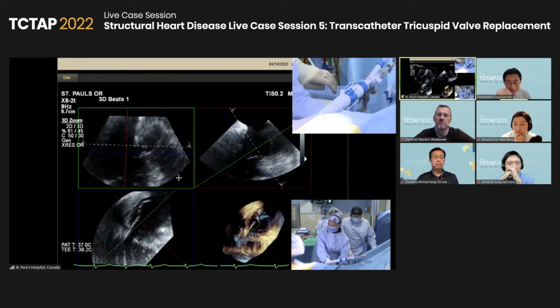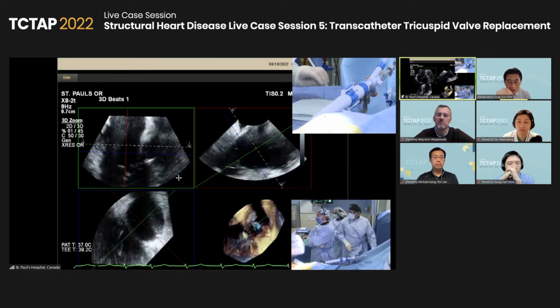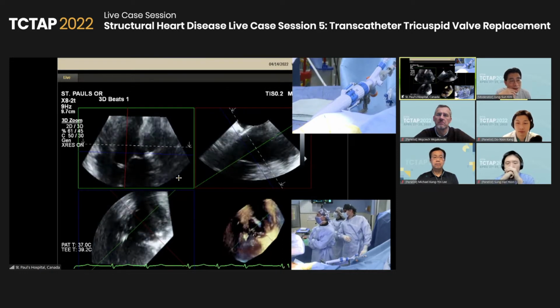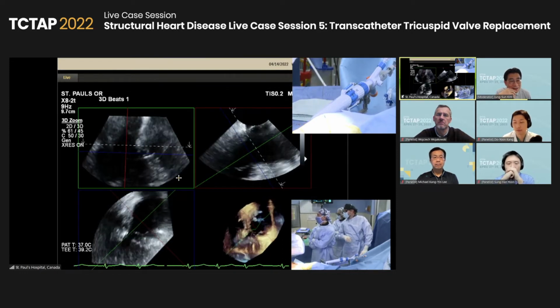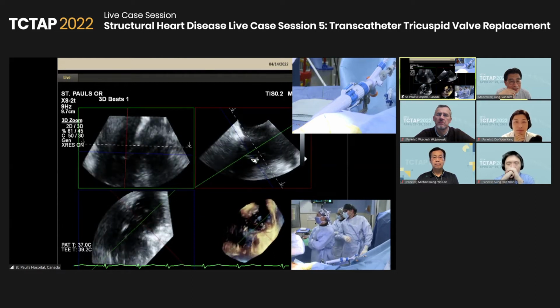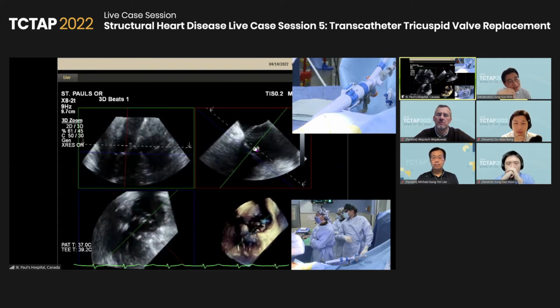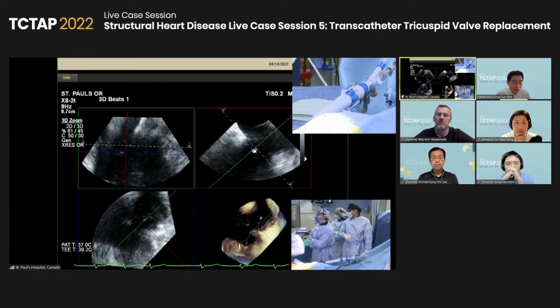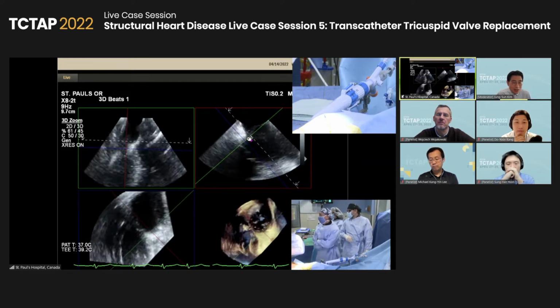Dr. Jung? Yes, I'm here. So it's not a very familiar procedure for the audience and analysts. So I think it is possible. If it's possible, could you explain in more detail the anatomy?